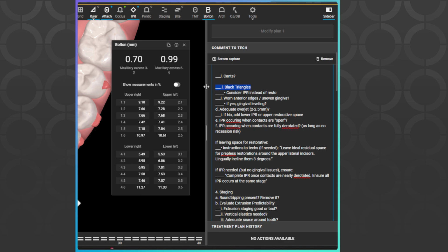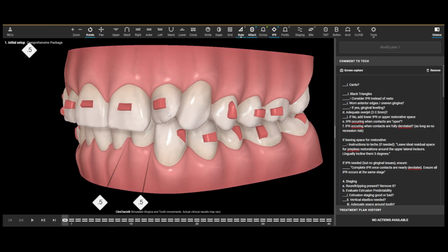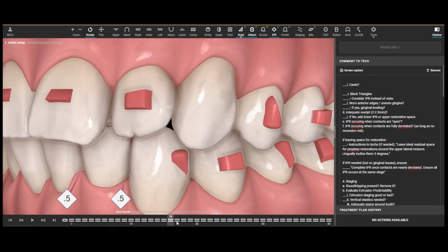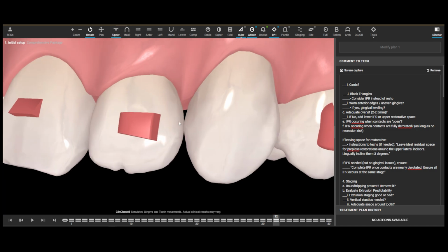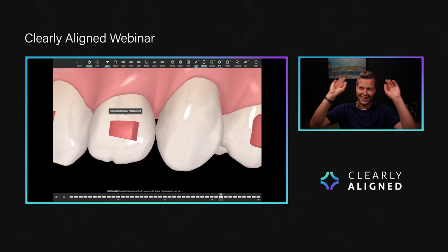The next thing would be black triangles. Will there be black triangles that could open up during treatment? Now, a good rule of thumb here is that anywhere that you have really crowded teeth, like between this lateral and this canine, you're going to see black triangles. It's just the fact that the gingiva has been compressed, and as you move these teeth, it will result in a black triangle, and the ClinCheck actually does an exceptional job of showing you those black triangles. It does a really, really good job of kind of predicting where they're gonna be in adults.